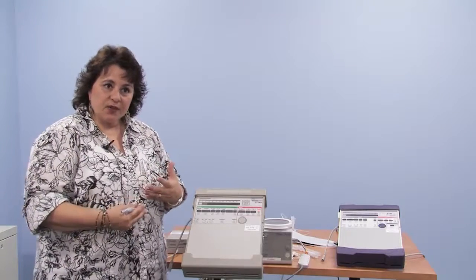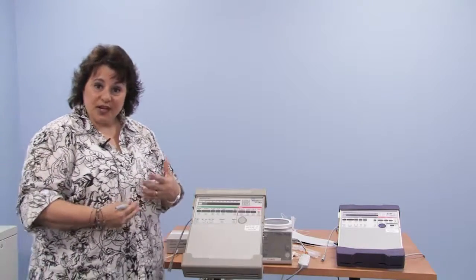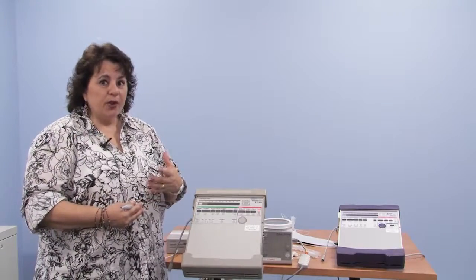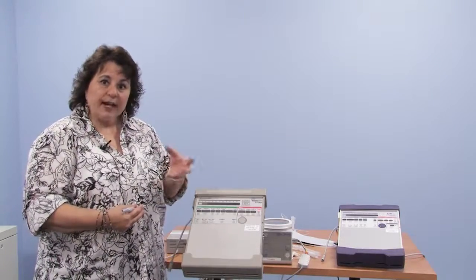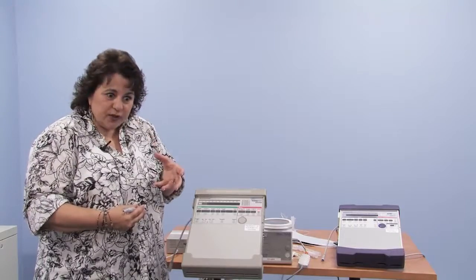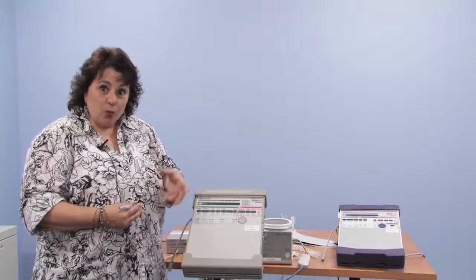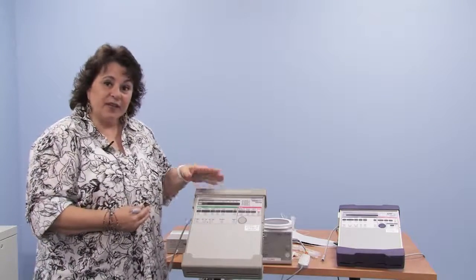So it's very comfortable typically for the child to initiate a breath and get one immediately, much quicker than when you use your handbag for hand ventilation. You look at the child's chest and you try to squeeze the bag with them. It's very difficult to get one-to-one with them, but the LTV can do that.